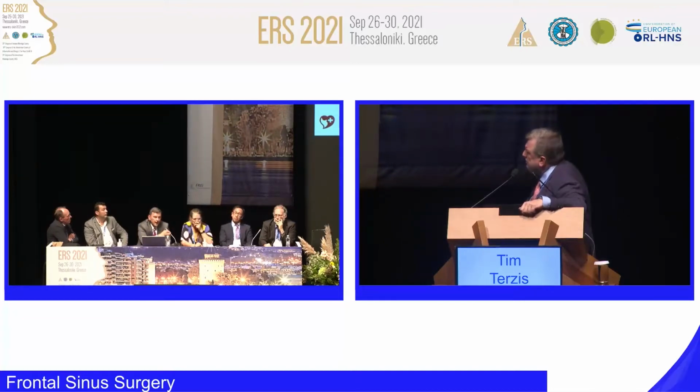Yes, and I will try to do a type 2B, because I see over the septum to the other side, I see also a connection to the other side. So I think I will try to perform a type 2B, but the final decision will be made intraoperatively. Okay, Philippe? For this case, I want 2 scans at least 3 months apart.